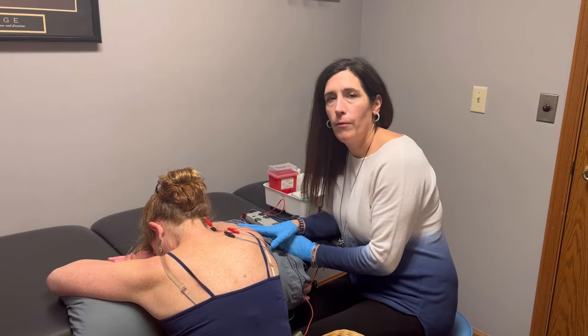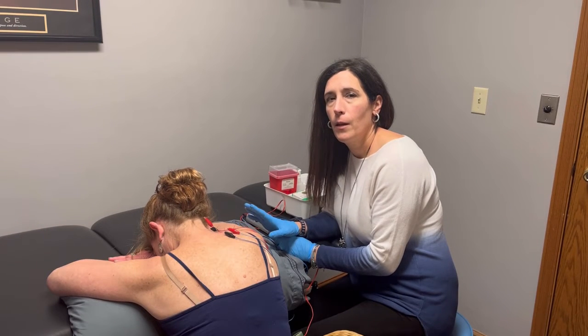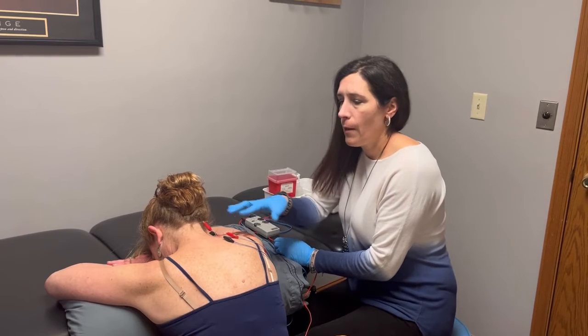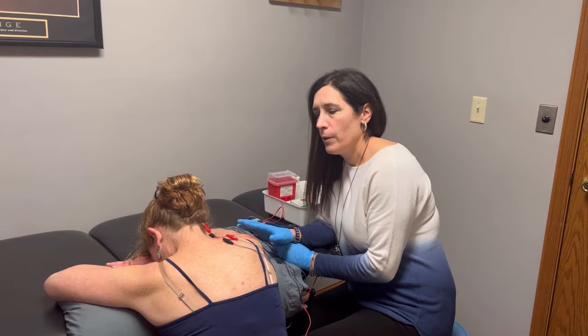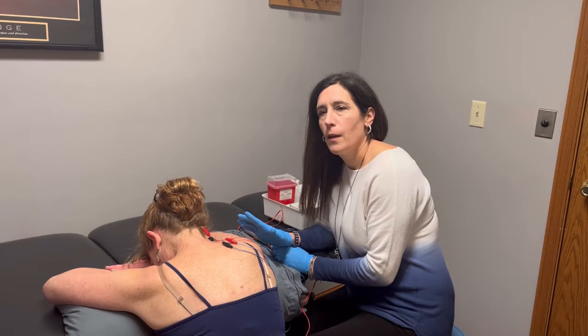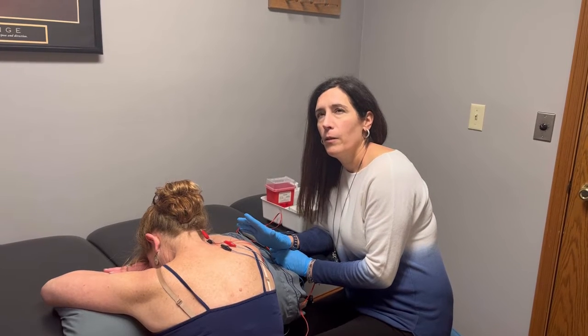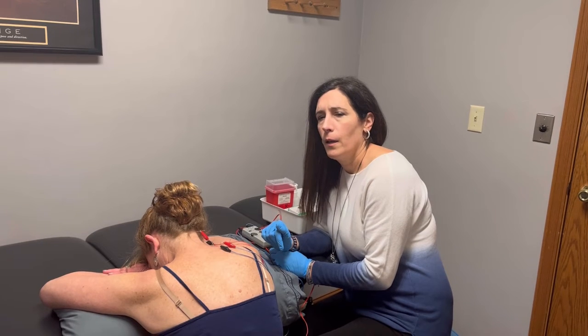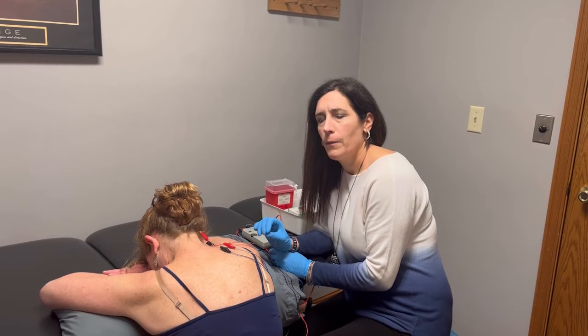Today we have a client who's having some right cervical neck pain, mostly levator scap and upper trap. She thinks possibly it's from sleeping on a pillow that maybe is too old, or she just needs to go out and buy something a little more firm.